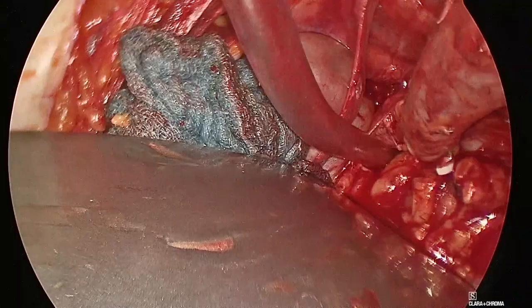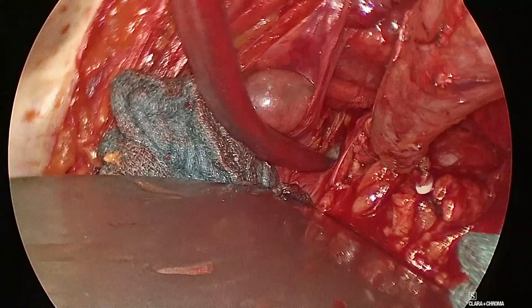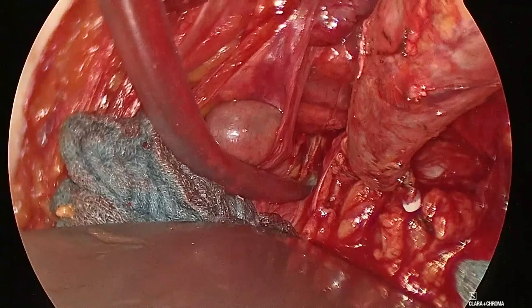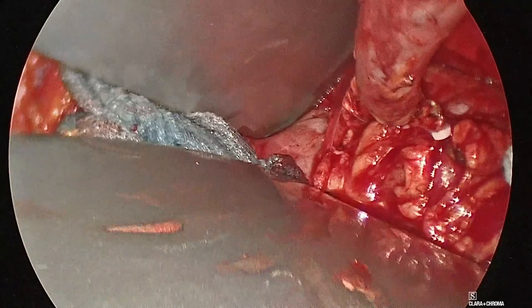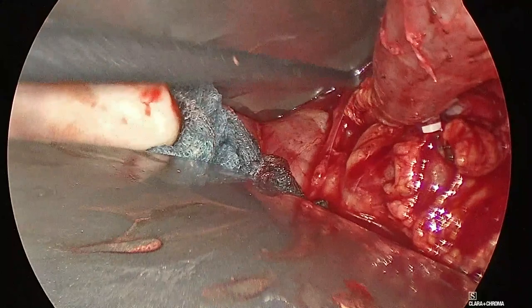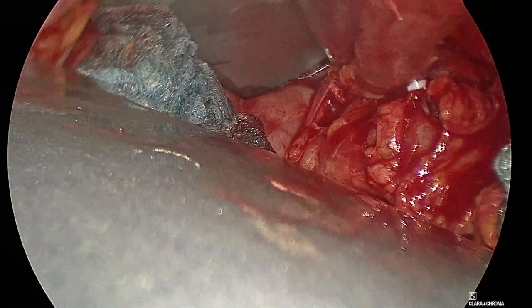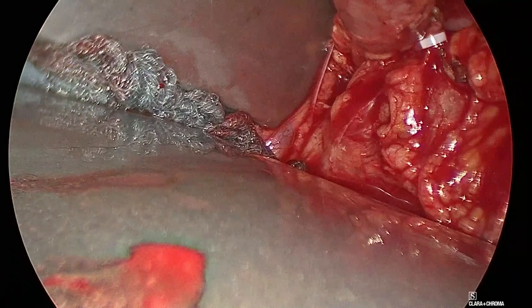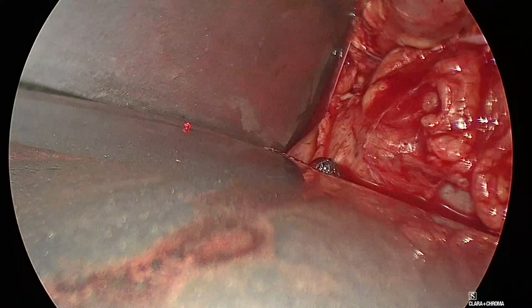Give me another one, a long one. So we are getting exactly, this one, but I need a long retractor, this one. Like that, okay, good, do I have it? And longer the becky. So we are getting exactly what I want to, so little by little. Si puedes probar a ver si lo puedes enganchar. Espera un segundo, espera. Así, eso es. Ya está.